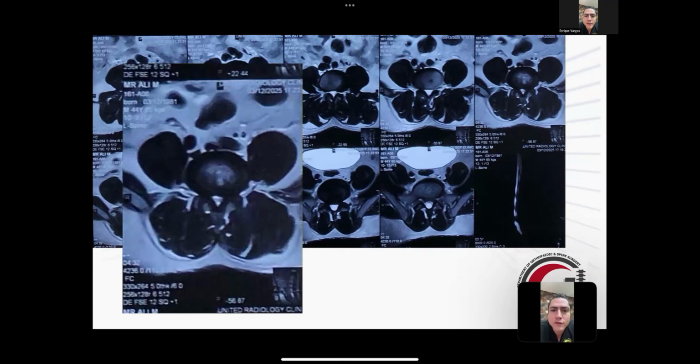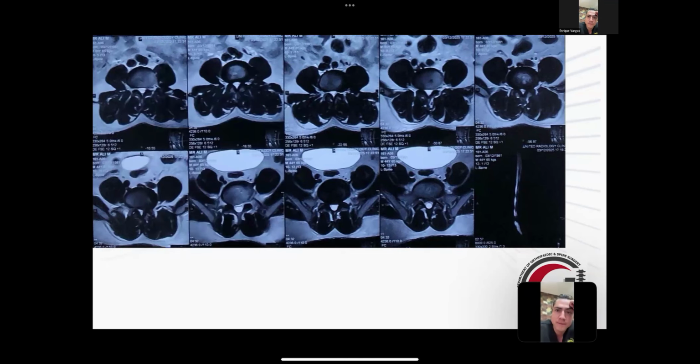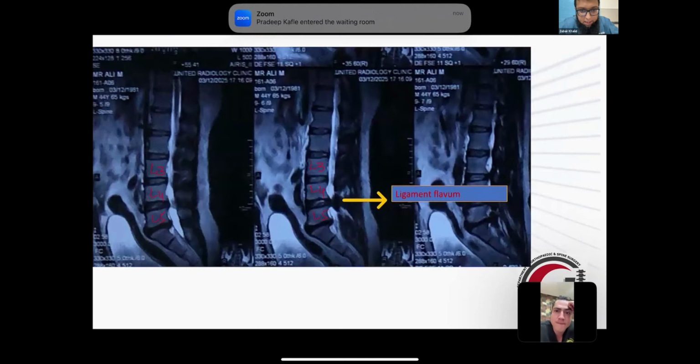Great case, Dr. Khalid. How do you think the L5-S1 disc behaves? Do you expect any changes after your surgery? There is a chance of segmental disease after surgery, but as we have very small bone resection at this region with minimally invasive techniques, the chances of instability and end plate changes are less as compared to open techniques.